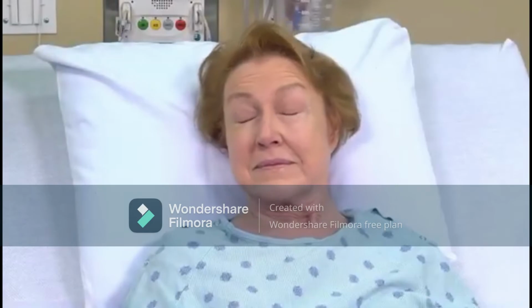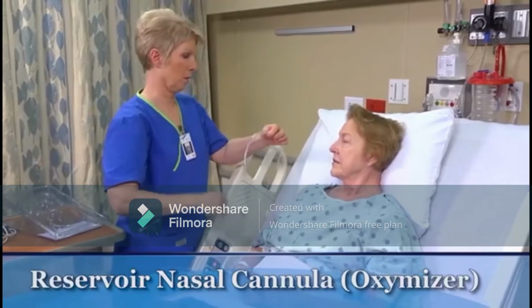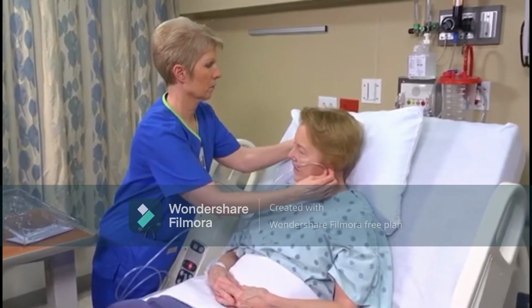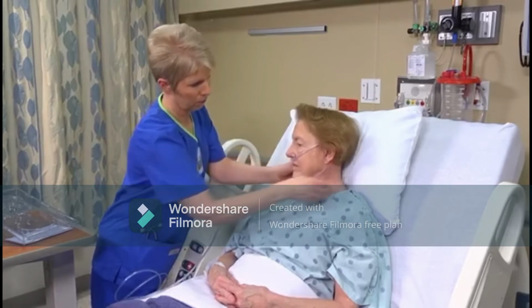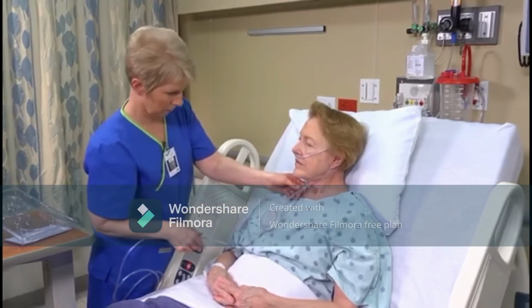Okay, Mrs. Hampton, I noticed that you're a little more short of breath. We're going to give you a little higher flow in oxygen here to help you out. A reservoir nasal cannula or oximizer is applied in a similar manner, but with the reservoir positioned beneath her nose or hanging like a pendant. Does it feel okay? I think so.